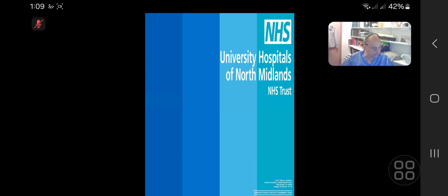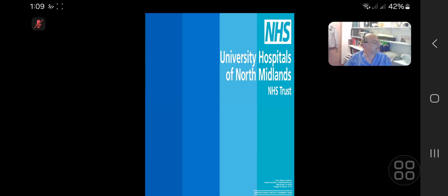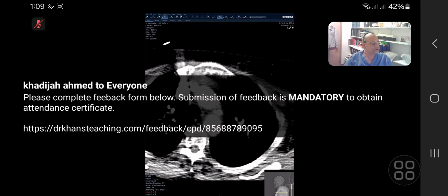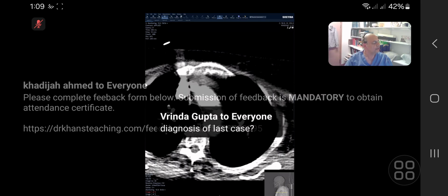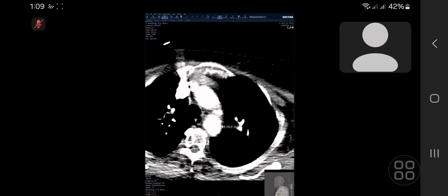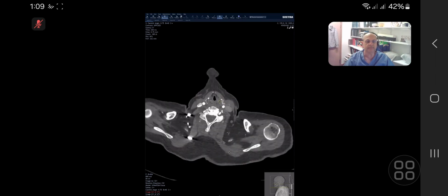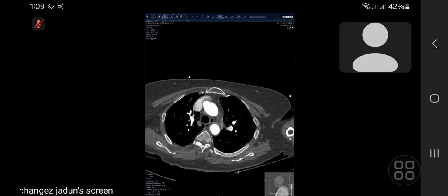Okay, so the last case coming to you. This is a patient who came to us for stroke, and the history given was aphasia, 4 a.m. today, lives at an adjacent hospital, NIHSS score of 22, left M1 occlusion, and I would straight give you the CT angiogram. Okay, so here you go.